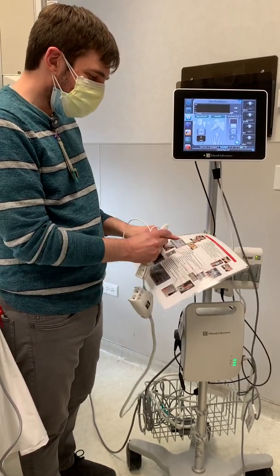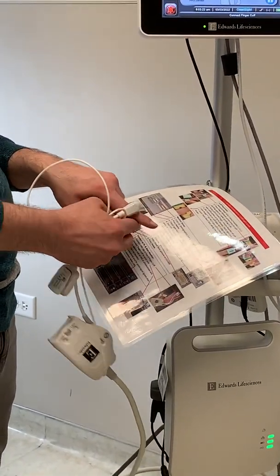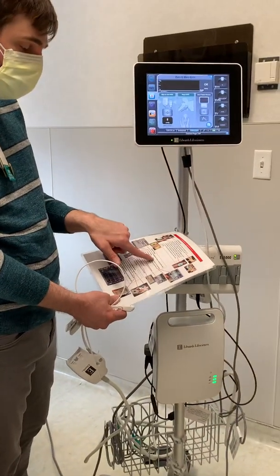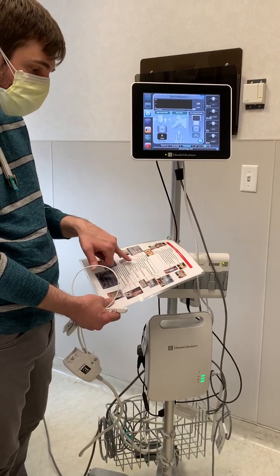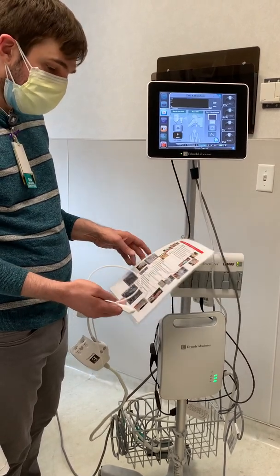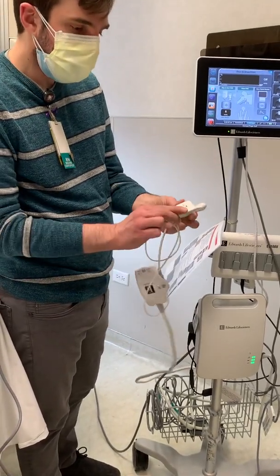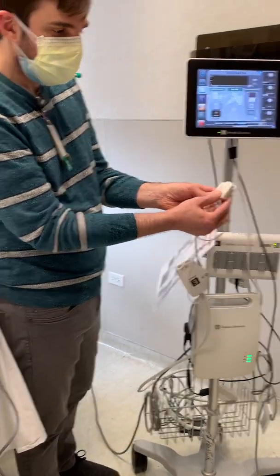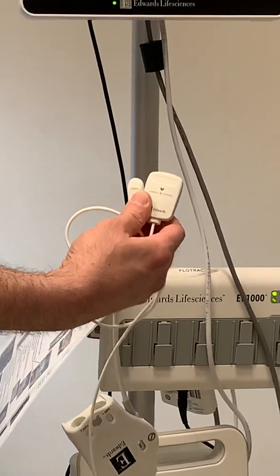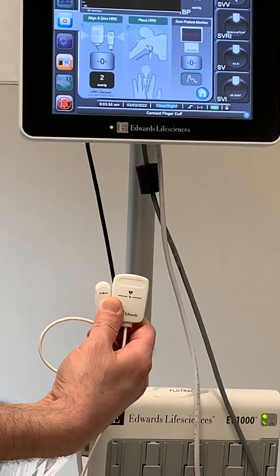You have to align the cuff and put it on between the two knuckles. You wrap it around — it's just like a little baby blood pressure cuff that goes on the finger, and that's where you get your information from. Back on the monitor screen, when you turn it on, enter the height, weight, gender, and age, then press home. You're going to have to zero these two pieces together. There's a line that says zero and zero — you just have to make sure they're at the same level, then hit the zero button. Done.